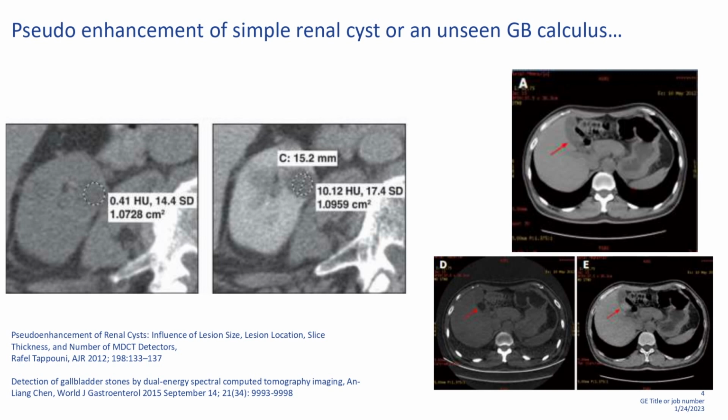So what was the reason? Since you are using a high power, the X-ray will go inside the cyst. When it goes inside the cyst, by default your Hounsfield unit will go up. The reason is your reconstruction algorithm is unable to understand what energy came. Pseudo enhancement of the cyst has happened. This is because of what problem? The polychromatic beam. You have seen that what you measure as Hounsfield is enhancing. Why is the cyst enhancing? This is because, again, of the issue with the polychromatic beam.